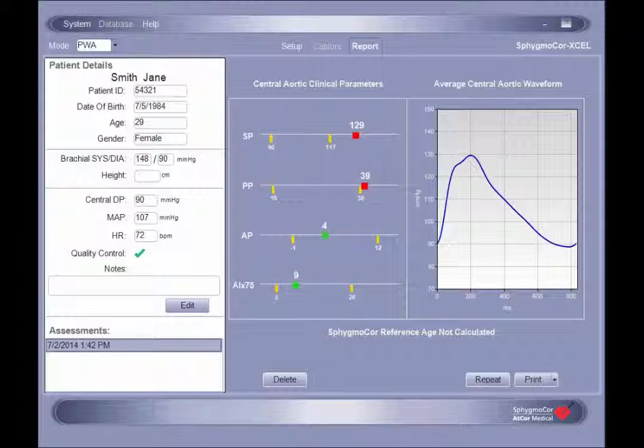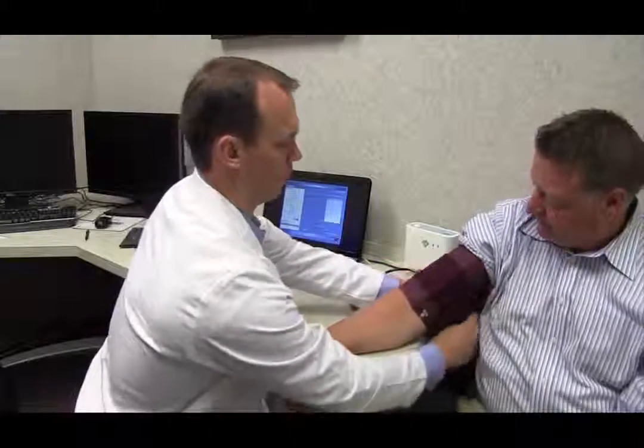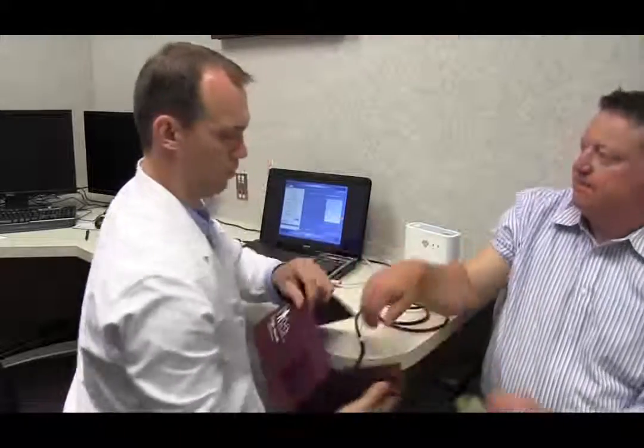If the computer has been configured with a printer, it is possible to print a hard copy of the report by clicking the Print button in the lower right-hand corner of the screen. Once an acceptable report is obtained, pulse wave analysis is completed and the cuff can be removed.